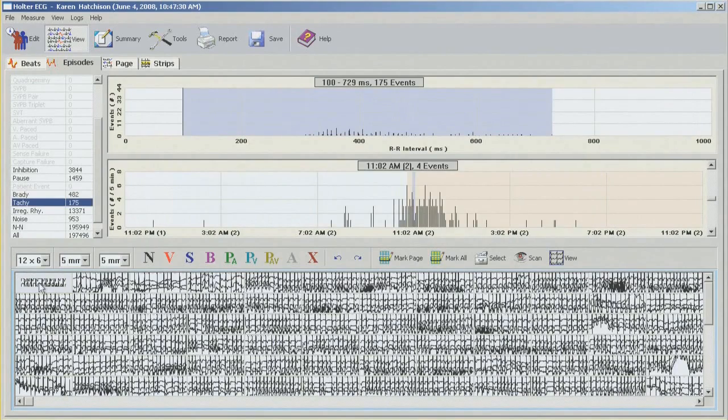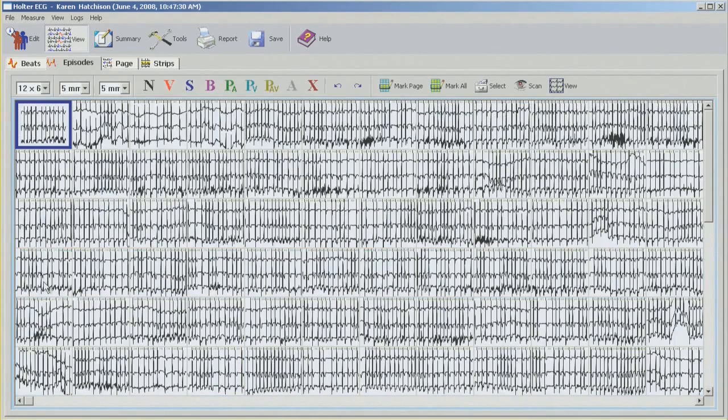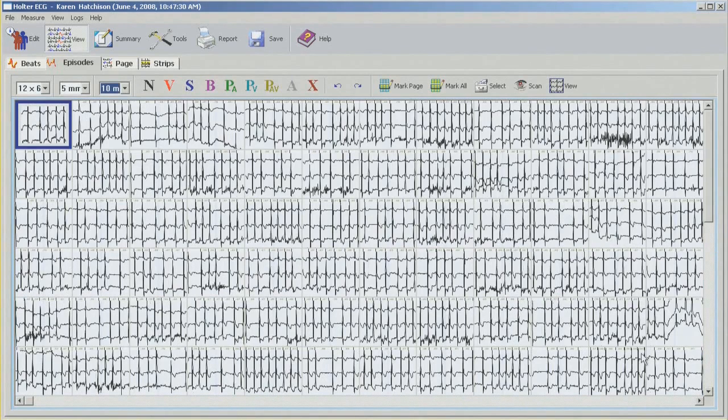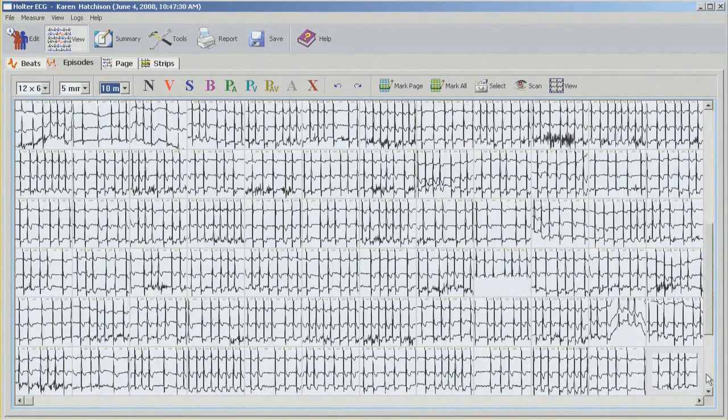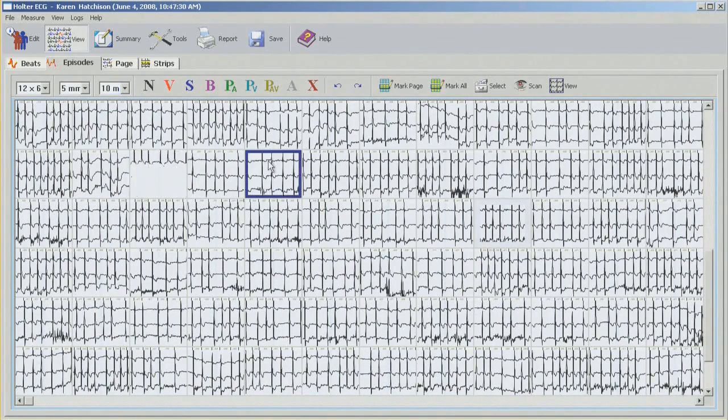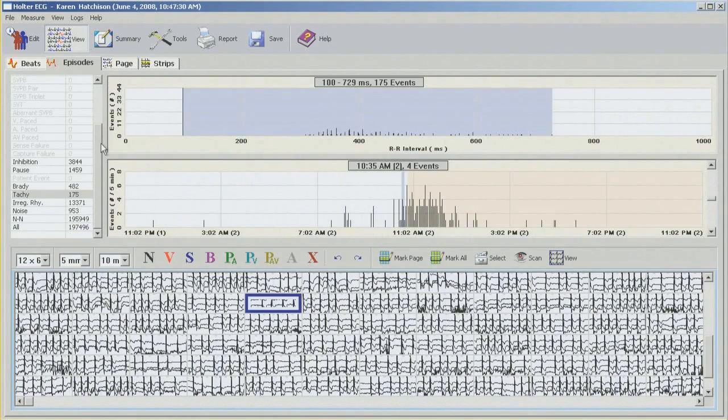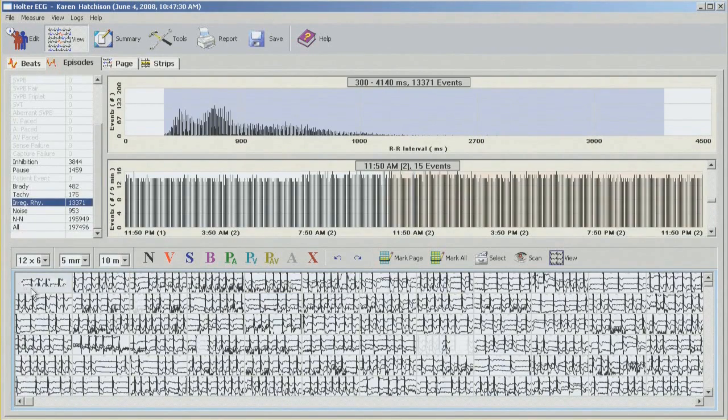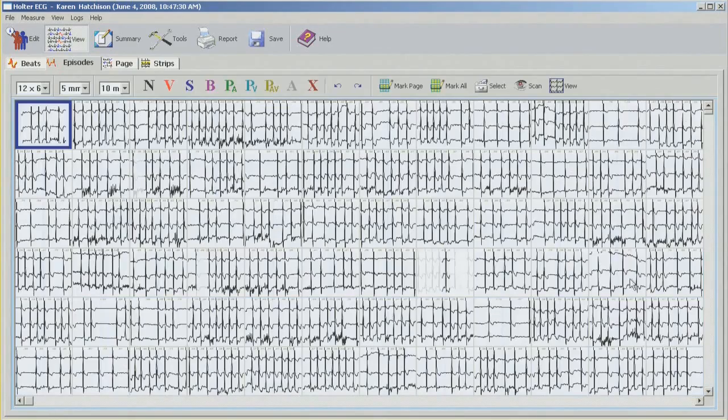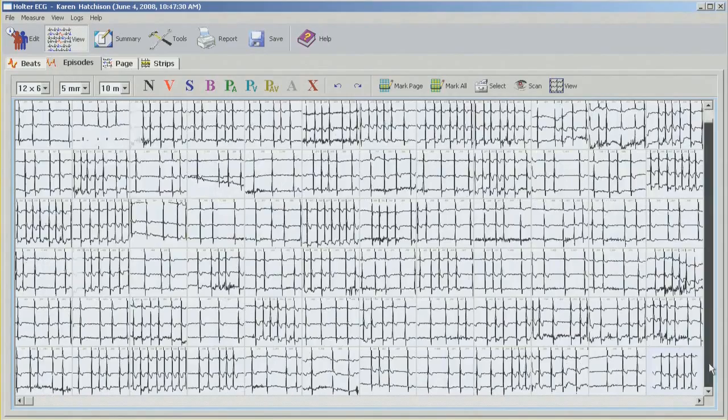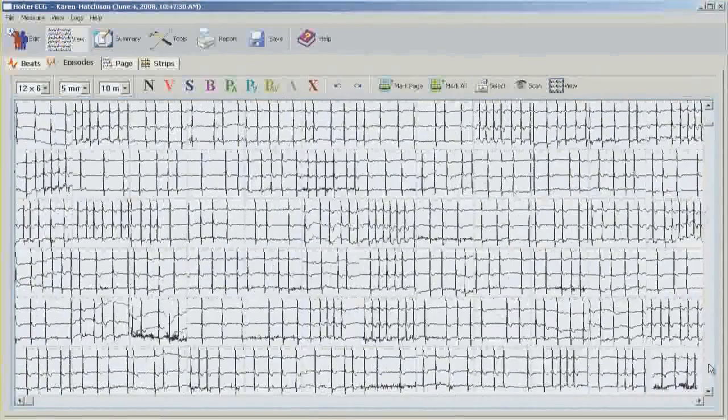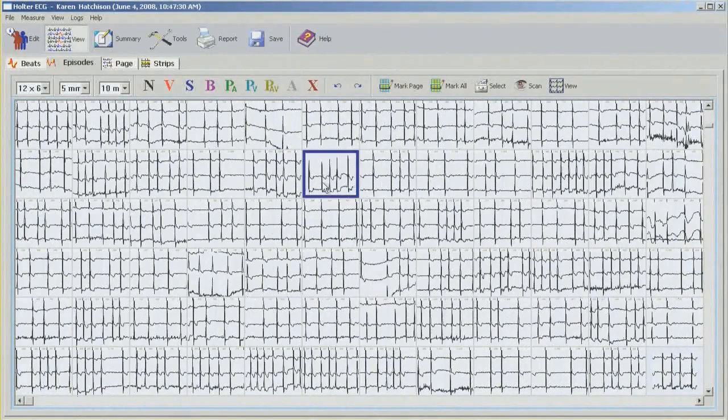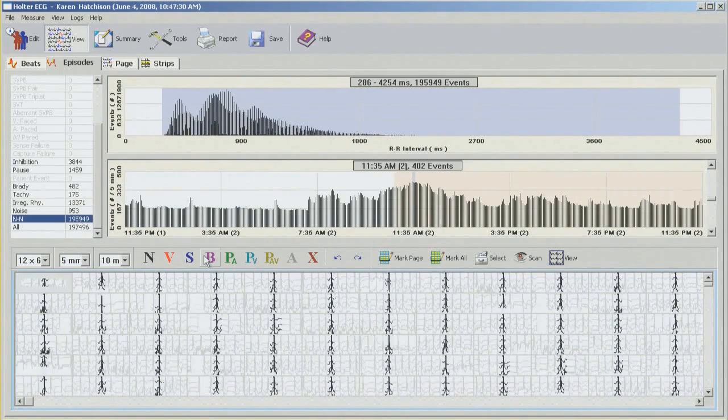Tachycardia episodes, 175. Again, Z button. Now here I'm going to change the speed to 10 because the rate is just too high for me to be able to see anything. And then quickly scroll through all the episodes here. Irregular, obviously this is AFib, so the whole recording is irregular, so we won't find anything here we don't already know.